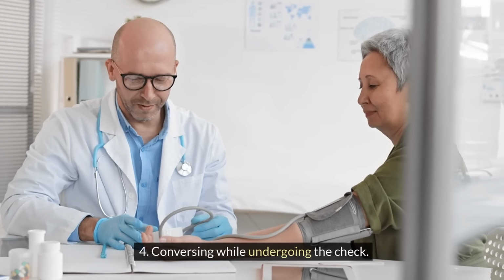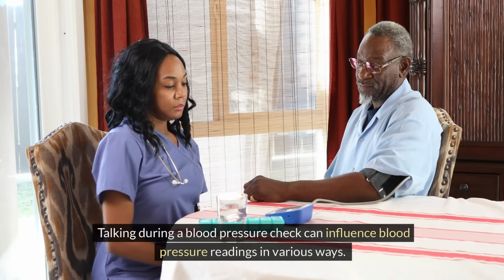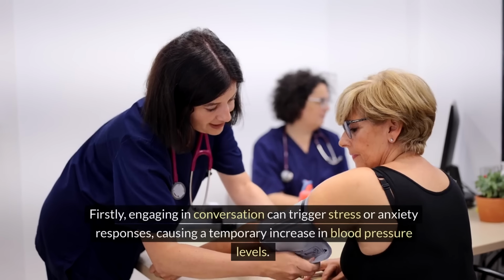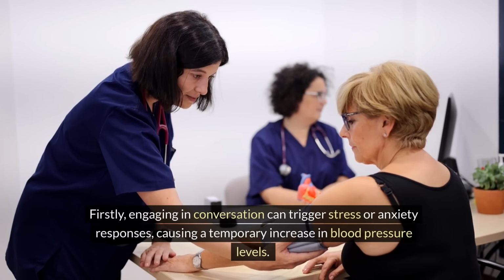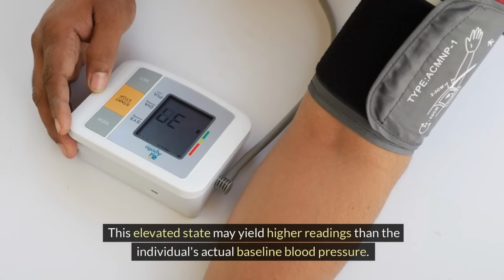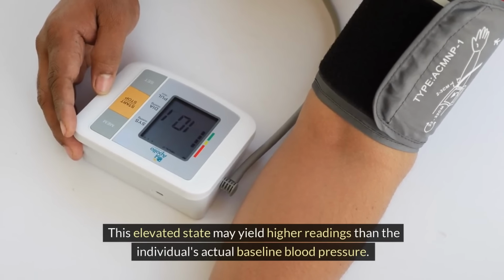4. Conversing while undergoing the check. Talking during a blood pressure check can influence blood pressure readings in various ways. Firstly, engaging in conversation can trigger stress or anxiety responses, causing a temporary increase in blood pressure levels. This elevated state may yield higher readings than the individual's actual baseline blood pressure.